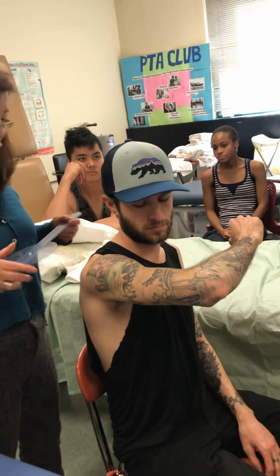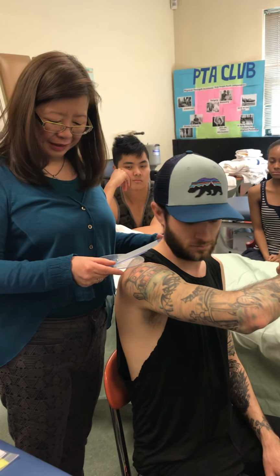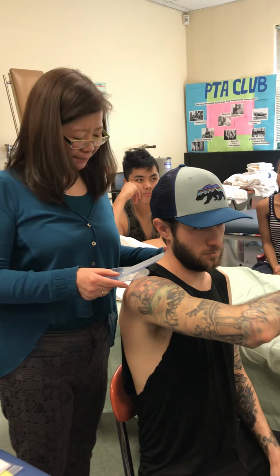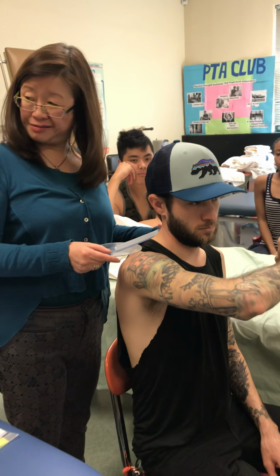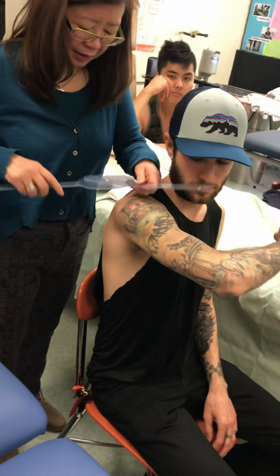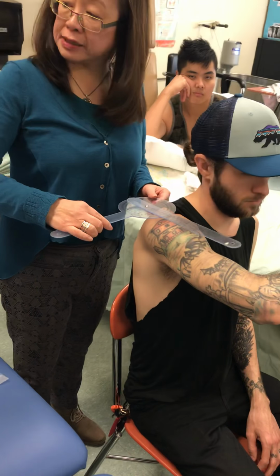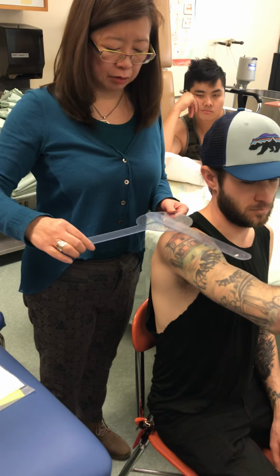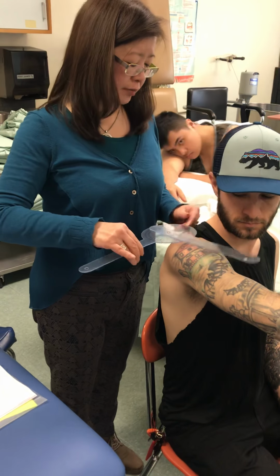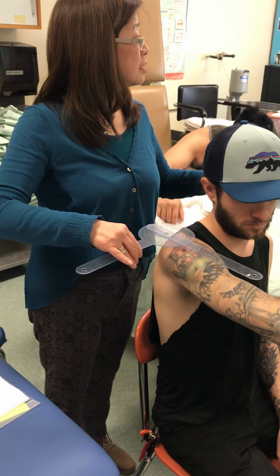Alrighty. Now, two things that you can do. I could keep it out here. But I'm going to be kind of far away from my axis point. Am I? Yes or no? Yes. Most people, it's going to be hard to tell. What if I just do this? And this. Is this still lined up with the base of his neck or the top of his trunk? His proximal arm. Yes or no? It is. All I have to do is use that imaginary line and extend it out. Does that make sense?